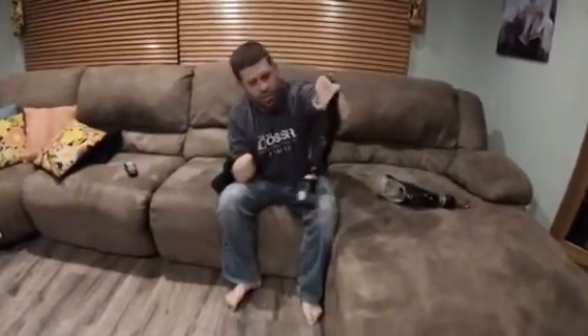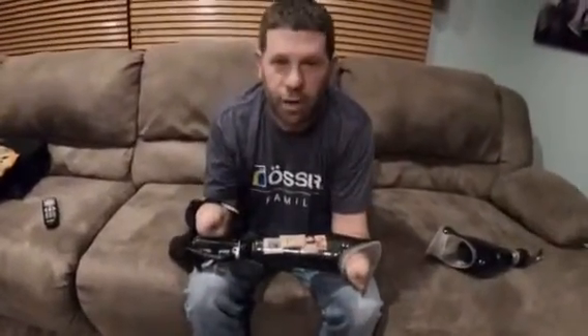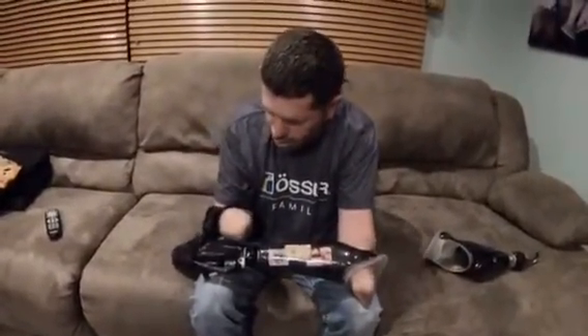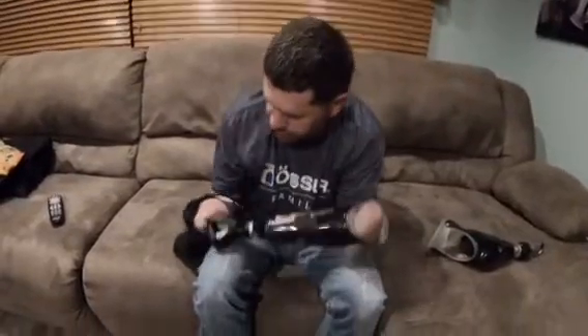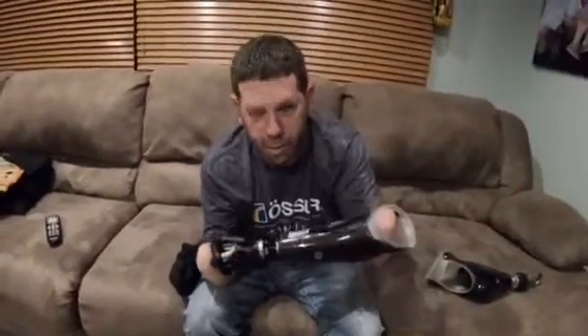Hey, my name is Jason Coger. I've been asked to show people how I turn my arms on and off. I'm going to put them on — this is the ILM Quantum. It does not have a glove on it right now just because I just got this hand back and haven't had time to put the glove on.